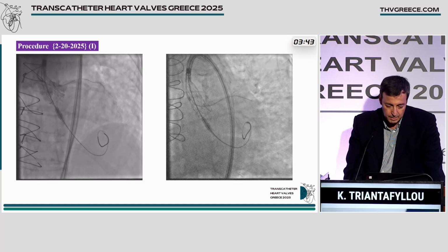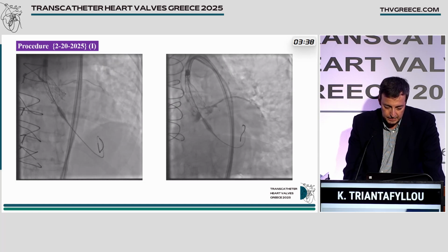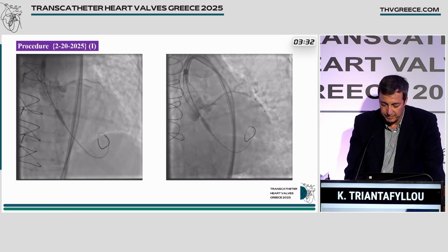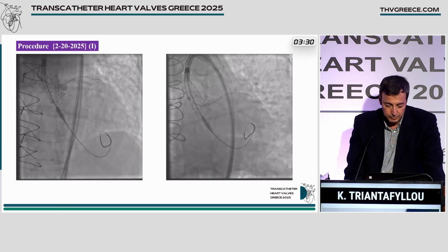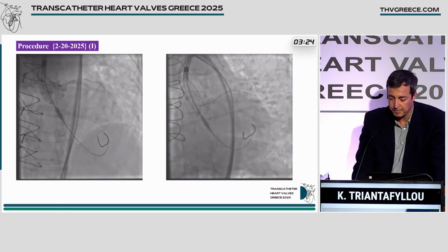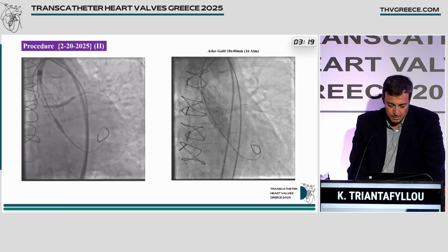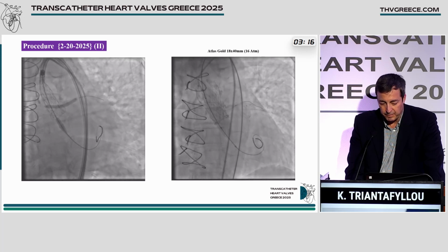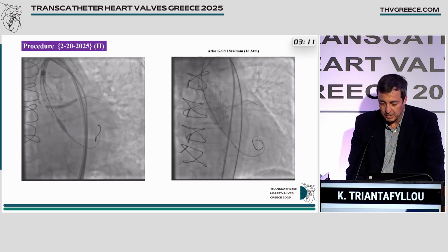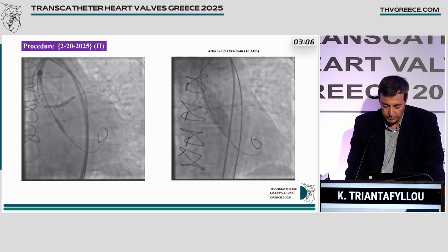So this is the initial part of our implantation. We see to the right mainly that the left main, if we release the valve without protecting the left main, probably would have closure. So this is a left system that is partially protected since we have a LIMA, but nevertheless we did not want to lose it. So before releasing the valve, we implant the stent, then we release the valve, and we do a post-dilatation with an Atlas Gold balloon at 18 millimeters at 16 atmospheres.